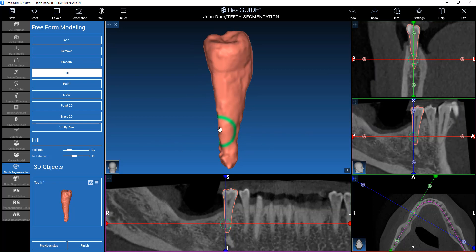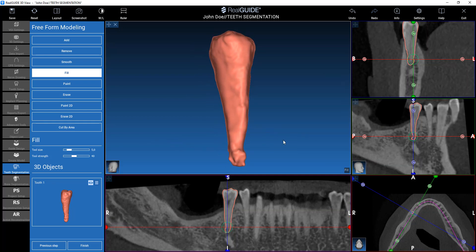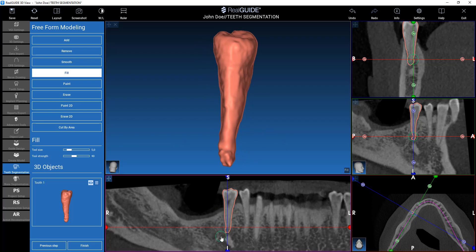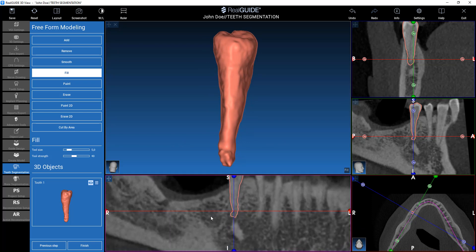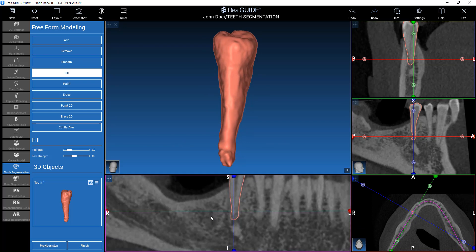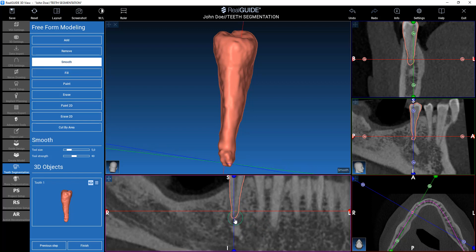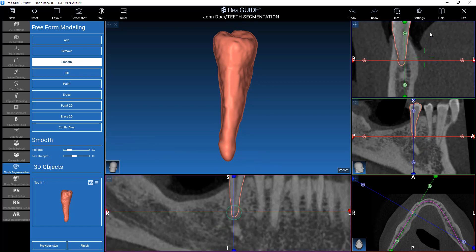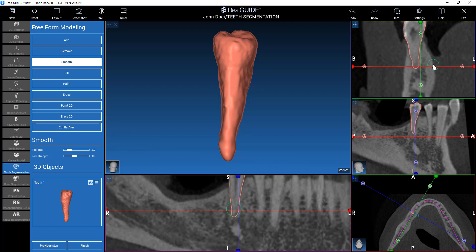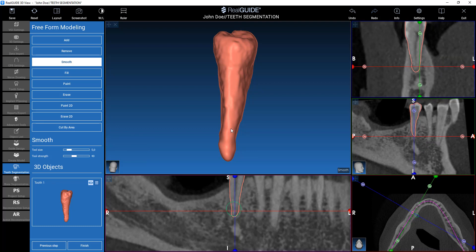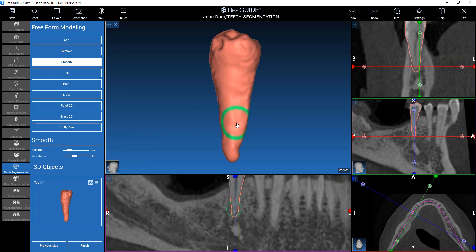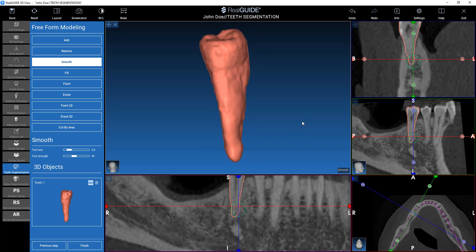I can use, for example, the fill command to smooth it a little bit. Fill is basically a very conservative closing tool. We can check on multiplanar images and use the smooth command to work on our tooth. All the commands are working both on 2D and 3D, so it's very easy to check the results of our operations.